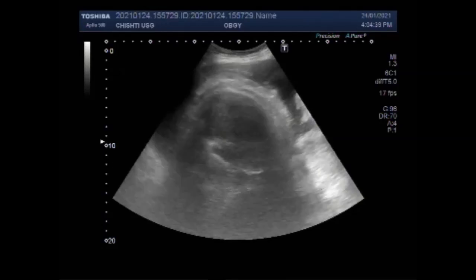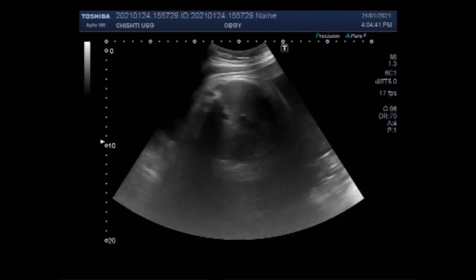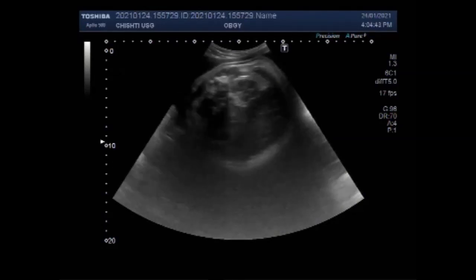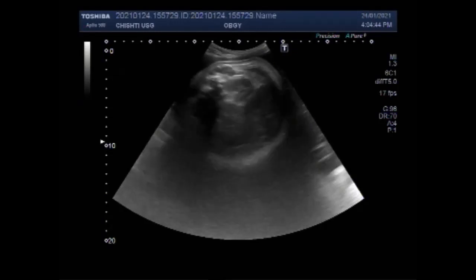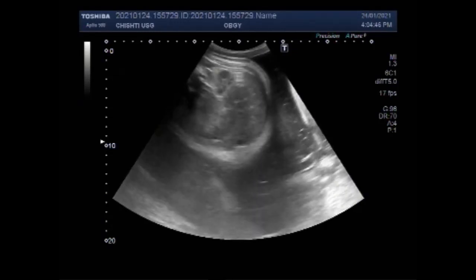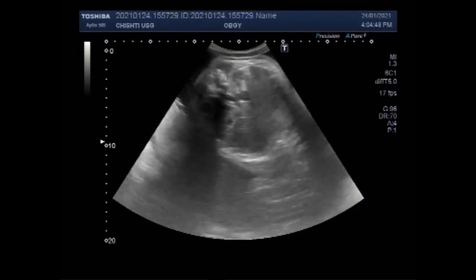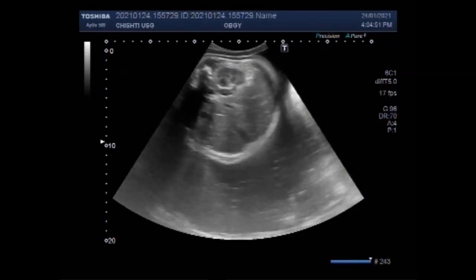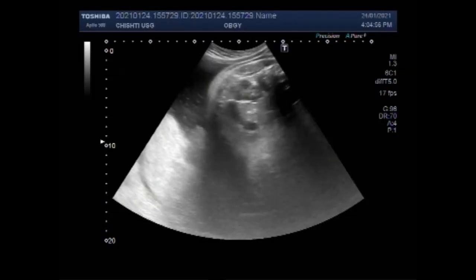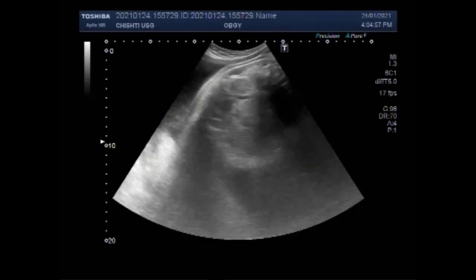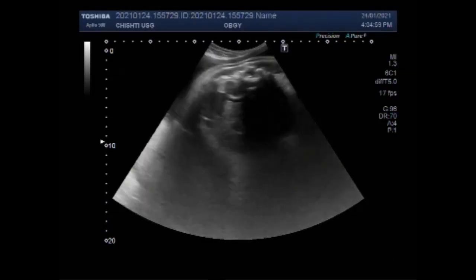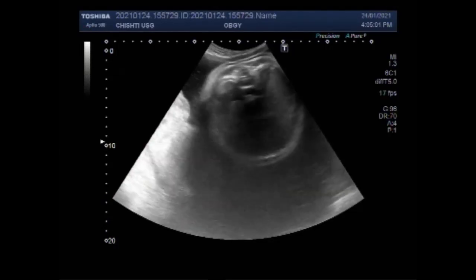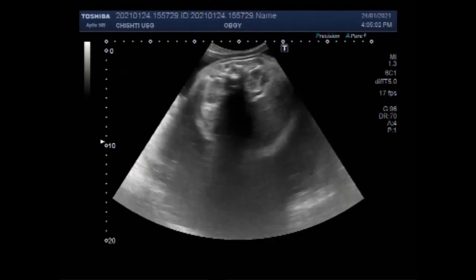Fetal anasarca refers to generalized fetal body edema and usually develops as a component of hydrops fetalis. The fetal subcutaneous tissue appears diffusely thickened, often to more than 5 mm. But in this case, the fetal soft tissue edema is only seen on the fetal head and neck.